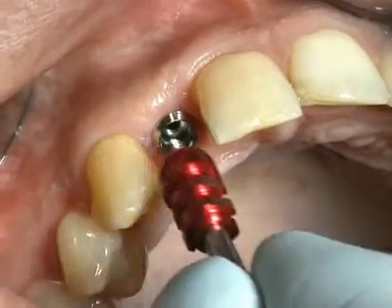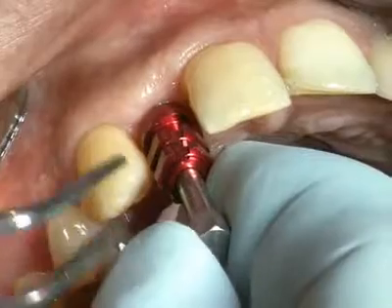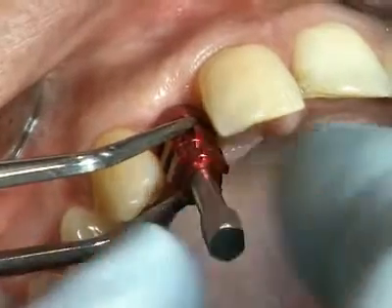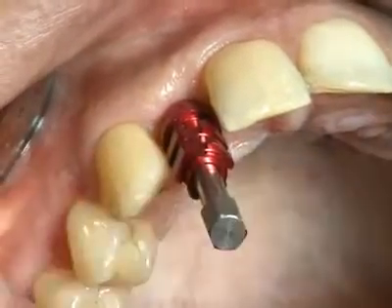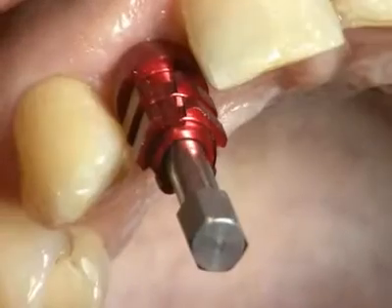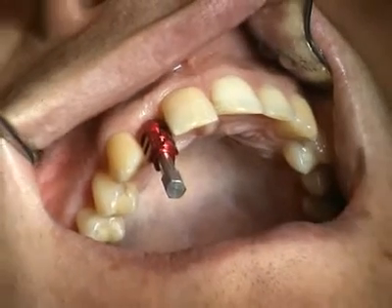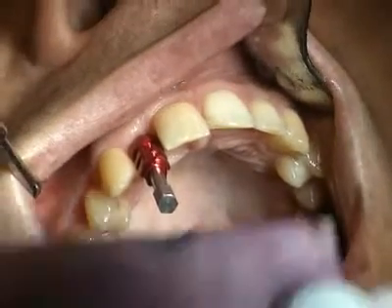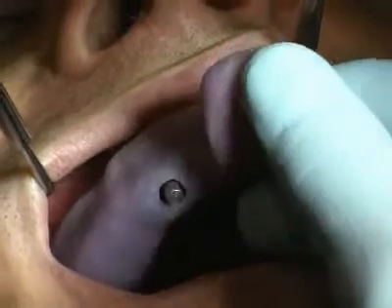Then the impression cap is placed on the implant shoulder using the integrated positioning screw. The impression is taken using a custom impression tray with suitable perforation and an elastomeric impression material.